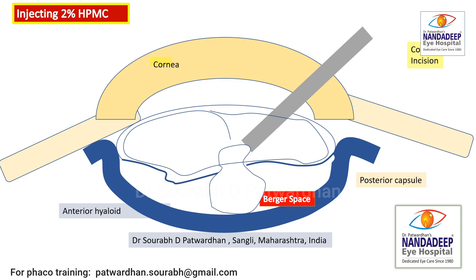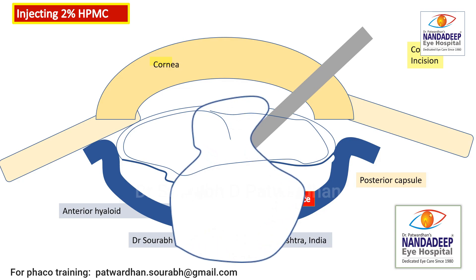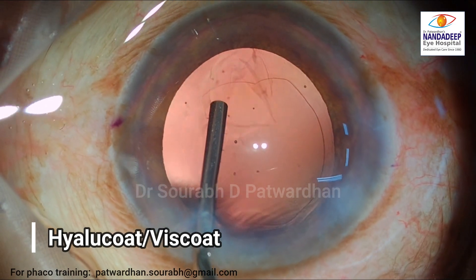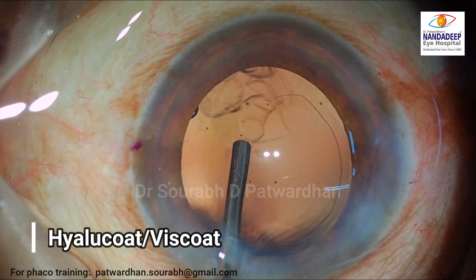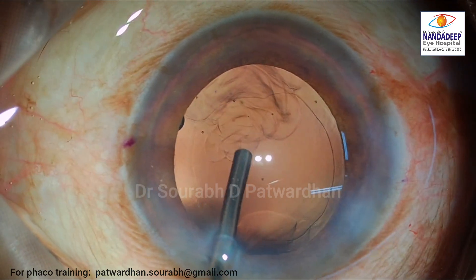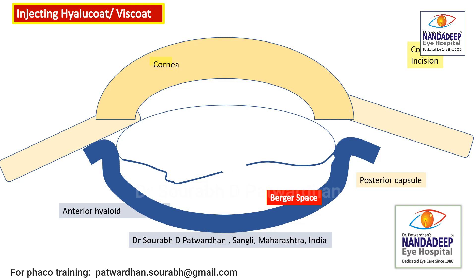In case of anterior hyaloid rupture, as shown in this animation, the visco goes down into the vitreous. This is how you can assess the intactness of the anterior hyaloid. Now I am injecting Hylucoat or Viscoat to plug the posterior capsule rent and placing it over the anterior hyaloid so it remains intact during the rest of the maneuvers — this is very important because we don't want to rupture the anterior hyaloid, which would lead to vitreous prolapse.